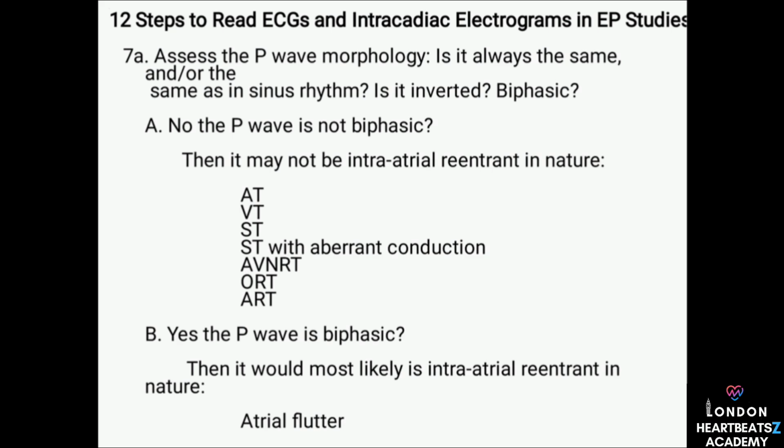If the P wave doesn't look like it does in a normal sinus rhythm, it tells us the rhythm isn't coming from the sinus node, the heart's natural pacemaker. Someone else has taken over the conductor's podium. So a weird-looking P wave is suspicious. Exactly. But what if it looks normal? Does that mean we're good to go? That's what I was wondering.